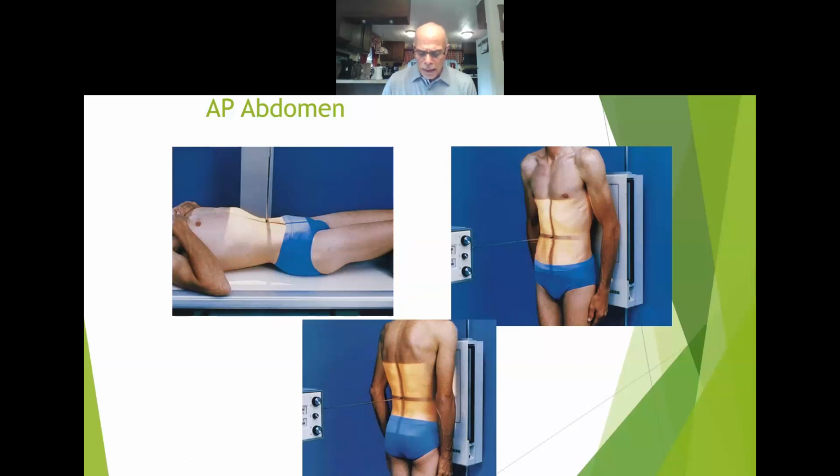And last bullet there, it says if the bladder is to be included on the upright image, this one right here, the IR collimated field is at the level of the iliac crest. So it becomes this, but just standing. So you do this at the iliac crest to L4. Here's L4 standing if you're going to get the bottom of the pubic symphysis. If you're interested in getting the diaphragm, to include the lower lobes of the lung field, you're going to go 2 inches above.